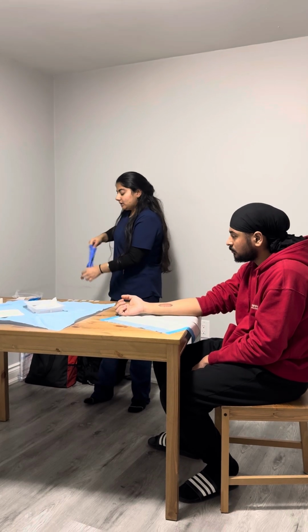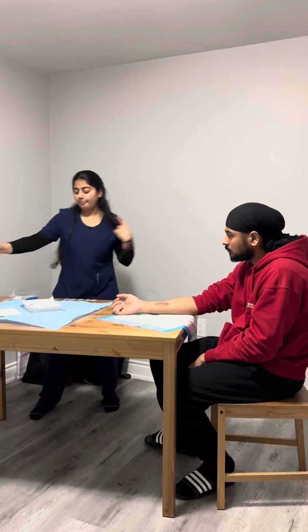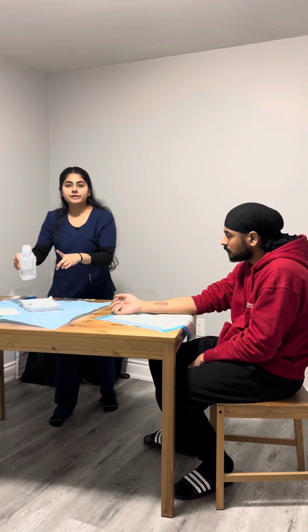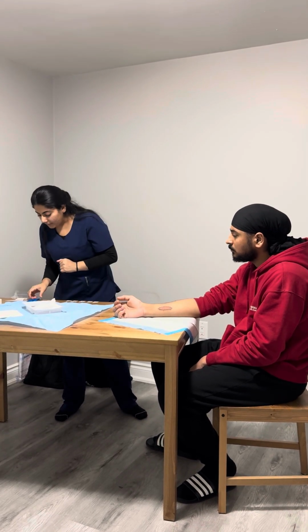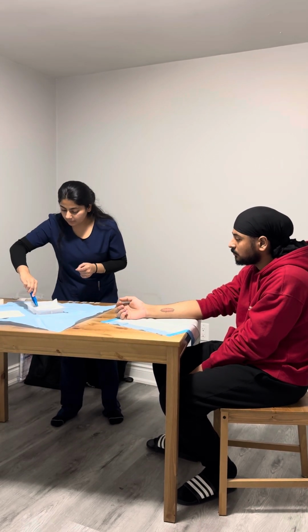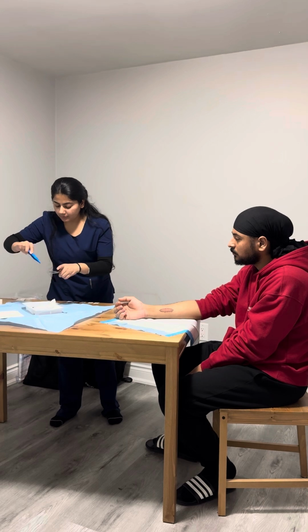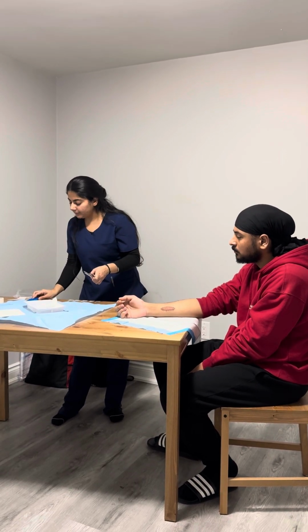I'm gonna discard it. Okay, I'm gonna do my hand hygiene. Okay, so I'll pour some normal saline to use to clean the wound afterwards. Okay, so Mr. Smith, I'll just clean the wound, okay? Okay, so I've done hand hygiene. I have put on a new pair of gloves, which are non-sterile. So I'm gonna use this forceps to get another forceps from the tray out. So one forceps here, and then second forceps here. I'm gonna put it back here.